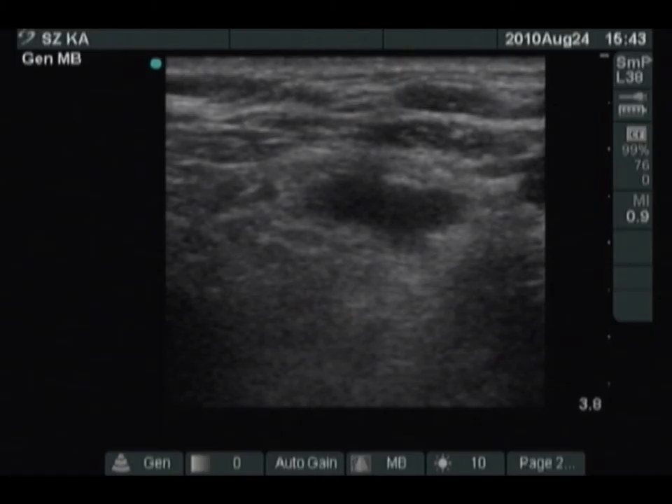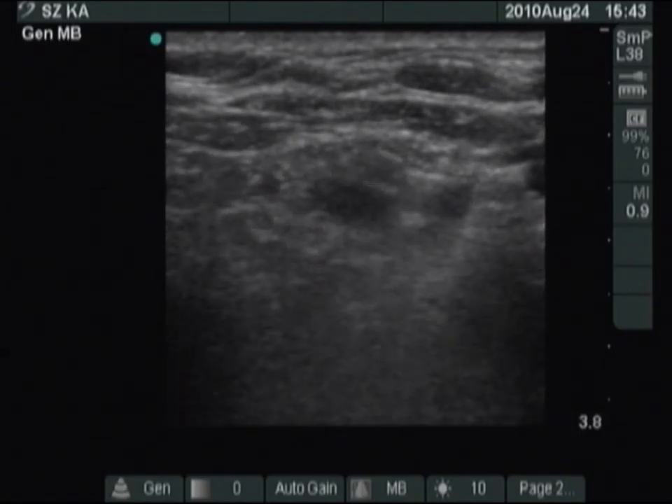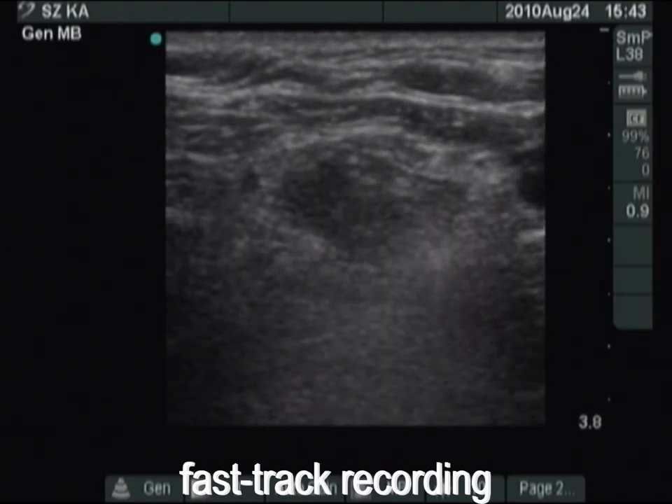So we have to move a bit more dorsal. And at last, the tip of the needle is clearly visible in the dorsal third of the lesion. We can start with the injection.